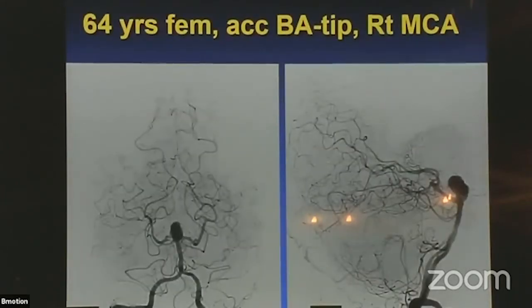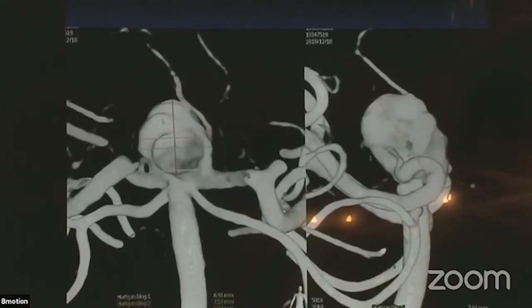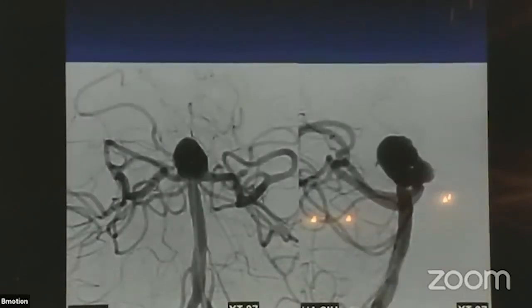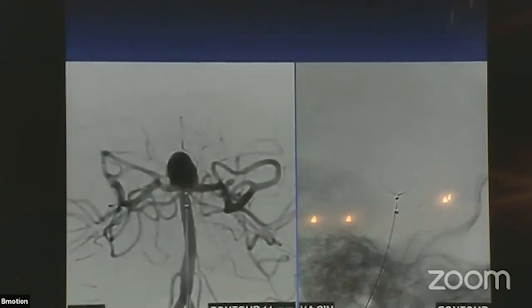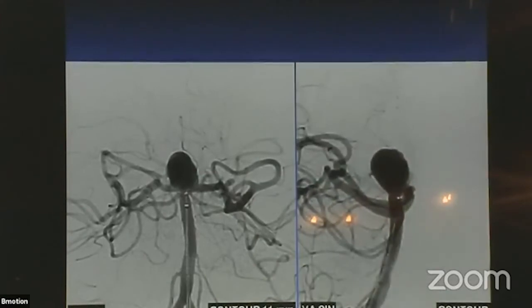Then came the first challenging case. This patient had two aneurysms — one at the basilar tip and one at the right MCA. The basilar was borderline in size — almost too big for the largest device. It was a wide-neck aneurysm. I don't like to treat small aneurysms with a new device just to show it's efficient. If it doesn't work in a challenging environment, I don't think it has any role. I used the XT27 and placed the 11-millimeter device.